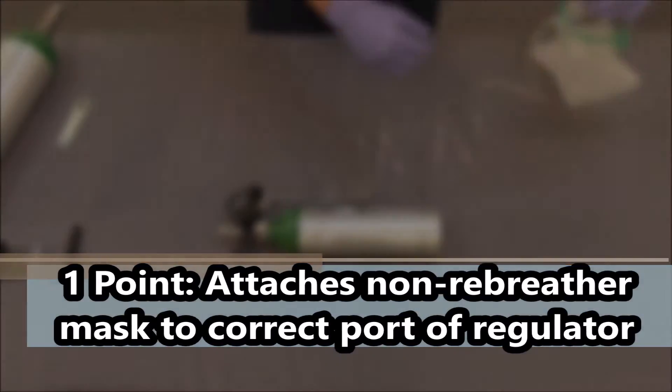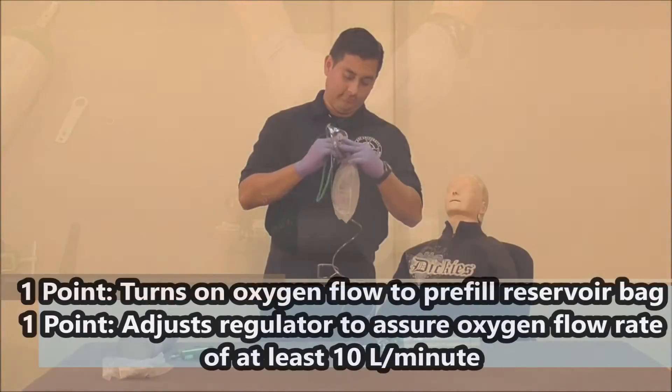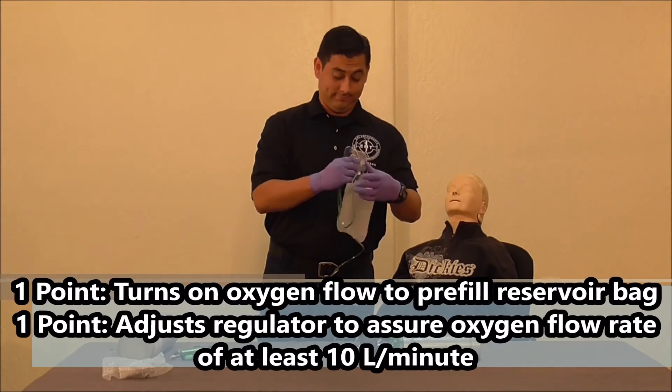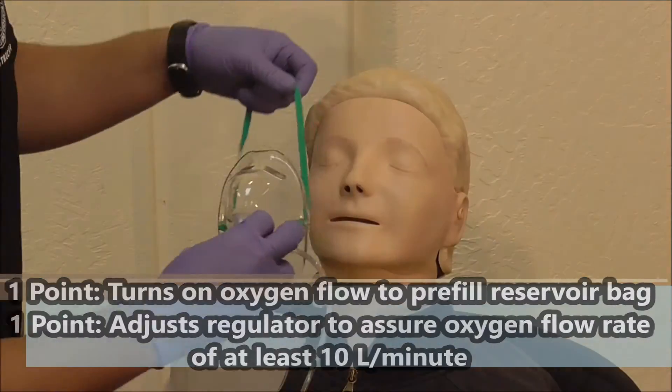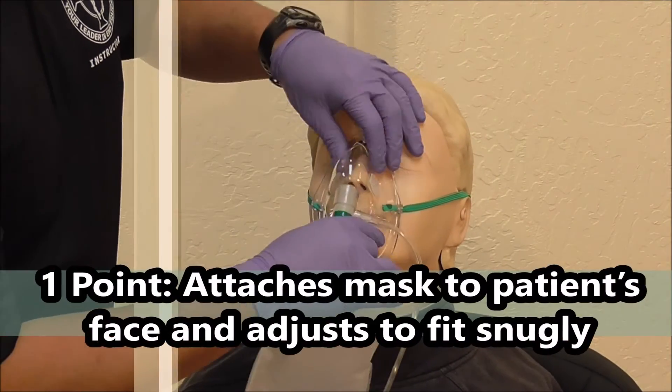Turn on the oxygen flow, pre-fill the reservoir bag, and adjust the regulator to assure an oxygen rate of at least 10 liters per minute. Finally, attach the mask to the patient's face and adjust it snugly.